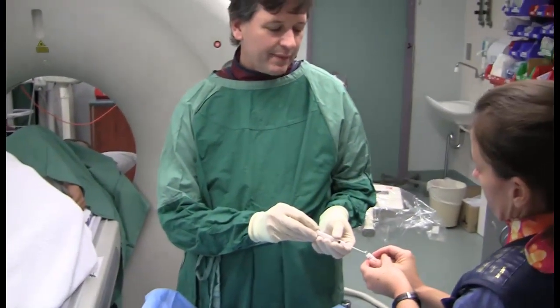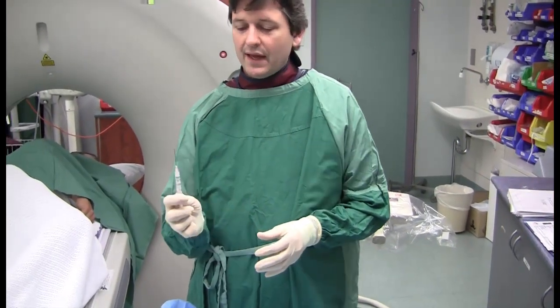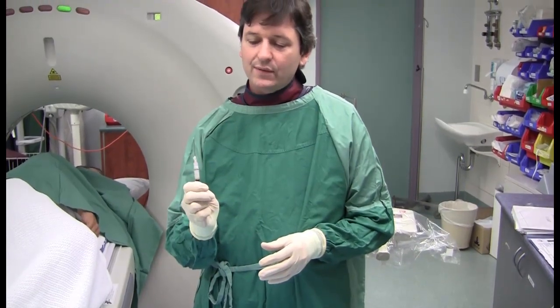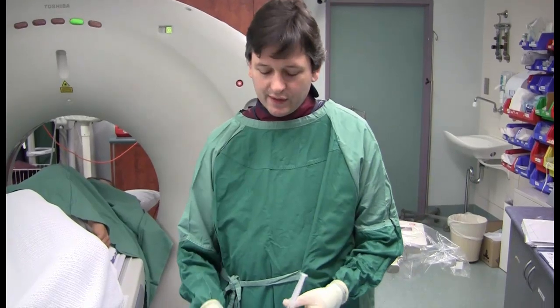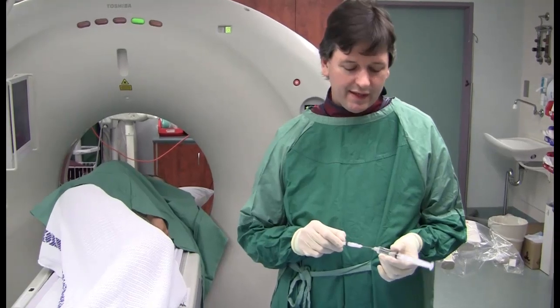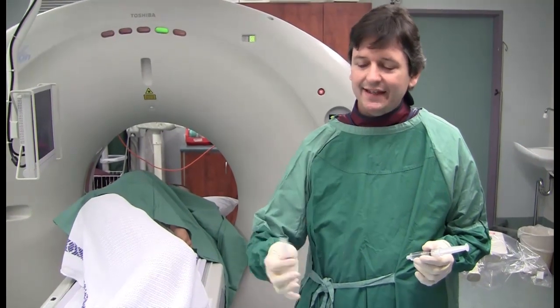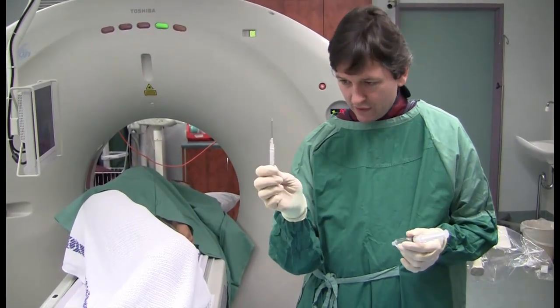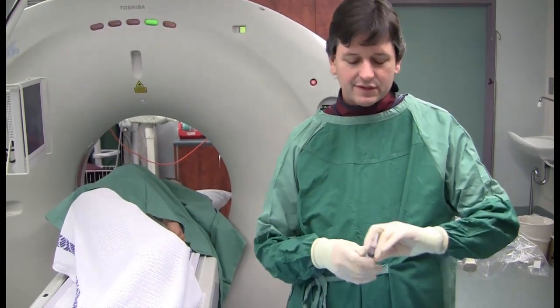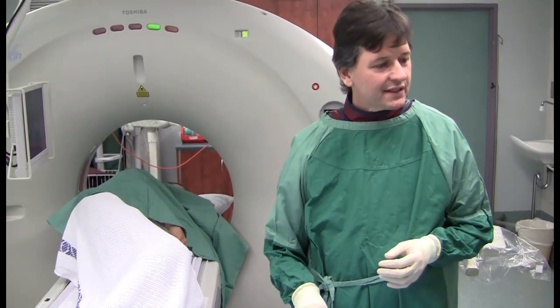We're using Celestone Chronidose as opposed to Kenacort. Celestone is a finer suspension and will go down a 25-gauge needle, whereas Kenacort A40 will not go down to 25-gauge. In thin candidates where we're chasing cervical facet joints close to the skin, you can use the local anaesthetic needle itself. In this situation we're chasing a nerve down to C8, the most difficult cervical nerve root to approach, so we're using the spinal needle and fluoroCT.